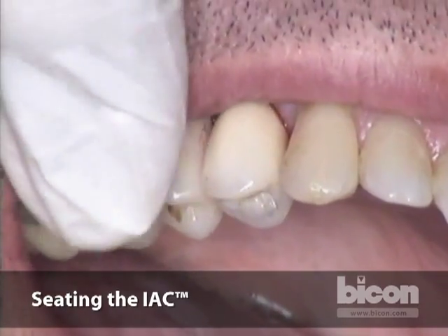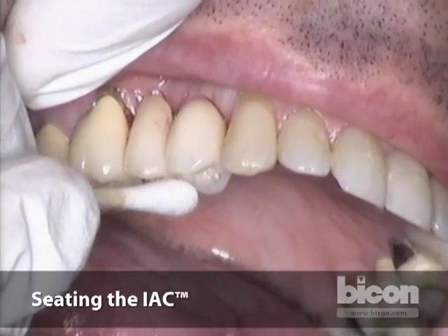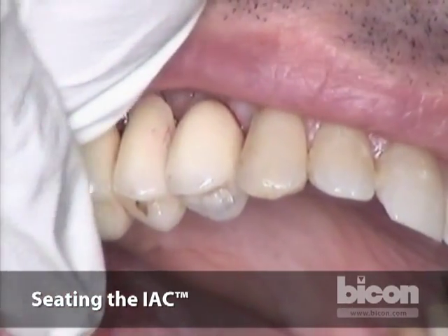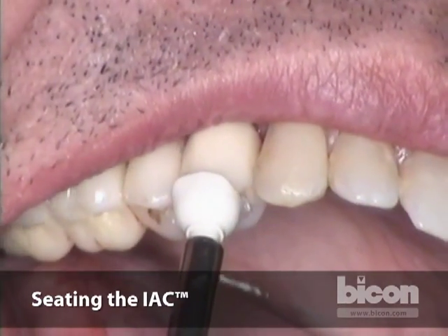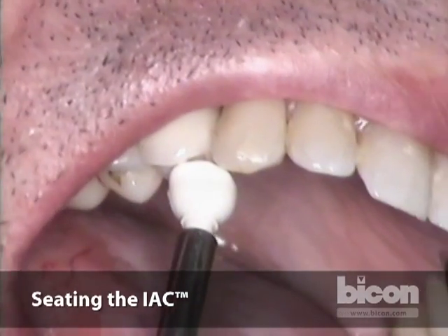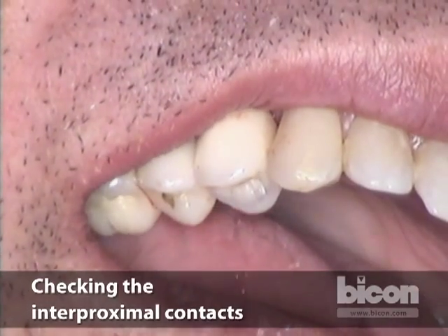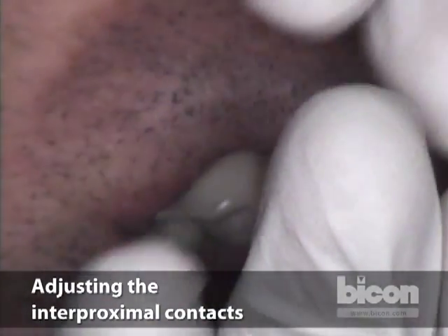Now I'm going to tap lightly on the crown to seat it down. There are different ways — Dr. Morgan's preferred way is to ask the patient to bite down into the crown with a cotton swab, and that seats the restoration. I prefer giving a little bit of taps because I love a hammer — just tap on each cusp: facial cusp, then lingual cusp. Then I'm going to check interproximal contacts one more time. The distal remains a little tight; I have a perfect mesial contact. The next way you can adjust interproximal contacts is with the use of a diamond strip.